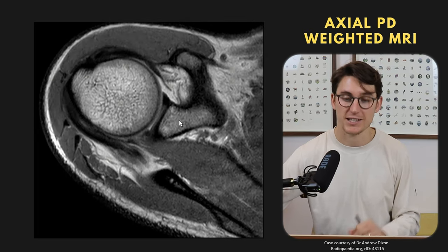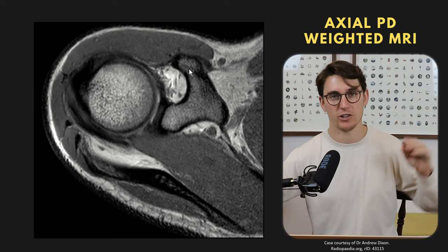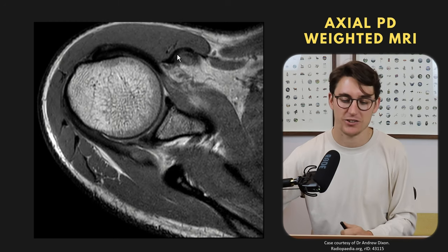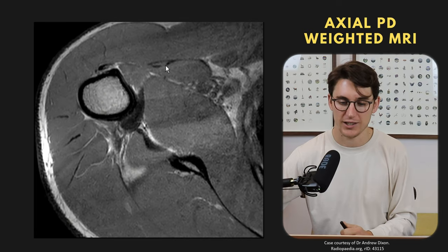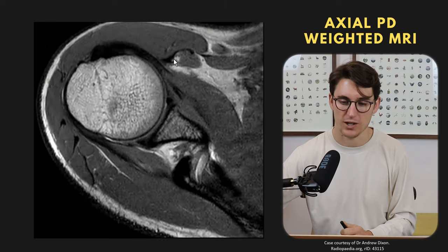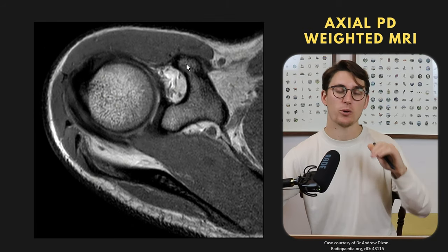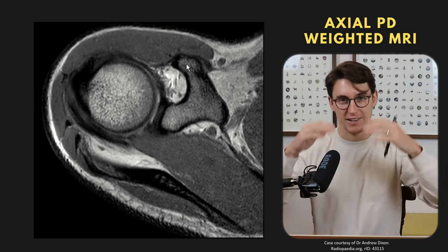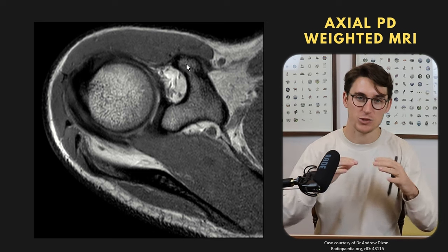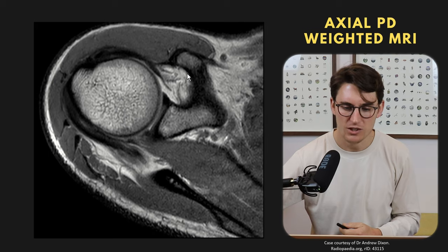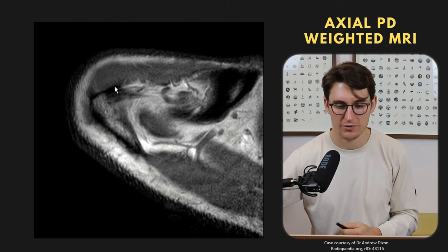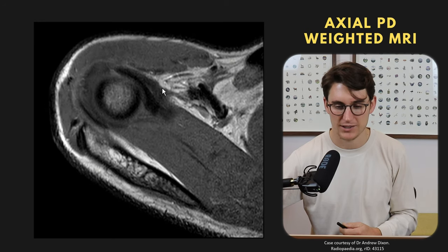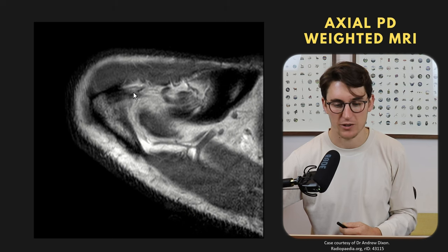Heading superiorly, we can see the coracoid process. We know the short head of biceps and coracobrachialis tendons attach to the anterior portion of the coracoid, and scrolling down we can see those tendons going into the arm. There's a really important coracoacromial ligament that makes the coracoacromial arch, which houses the subacromial subdeltoid bursa and supraspinatus tendon. It's sometimes easier to find this tendon by going up to the acromion first and following it back down to the coracoid.